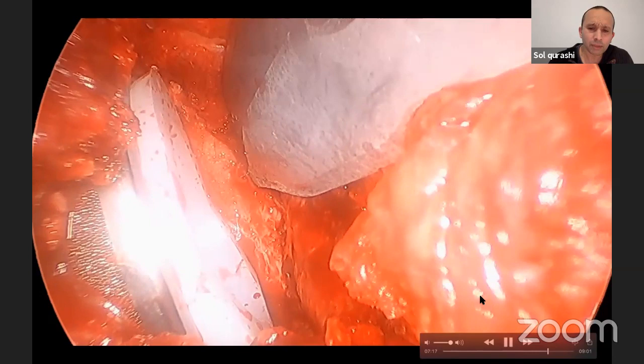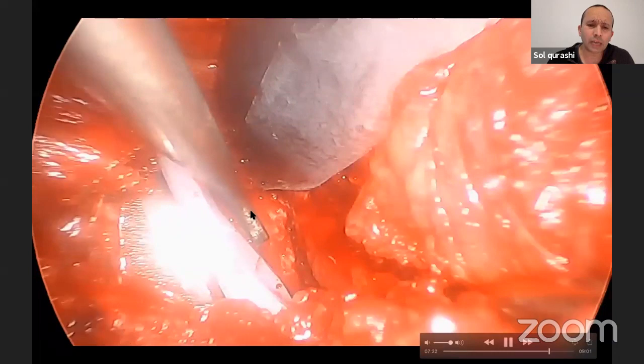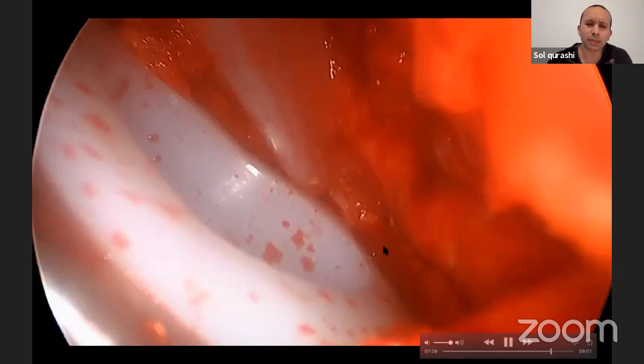So for the purposes of demonstration, I'm knocking off a little bit of an anterior osteophyte. You don't have to do that even if it impinges. Everything at the back is so tight, it's not going to let it pop out the back.